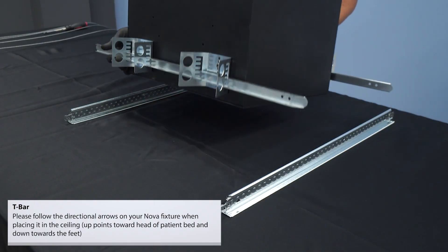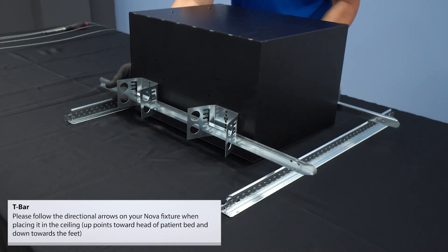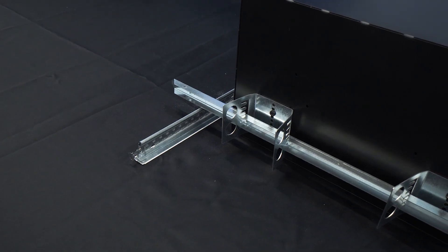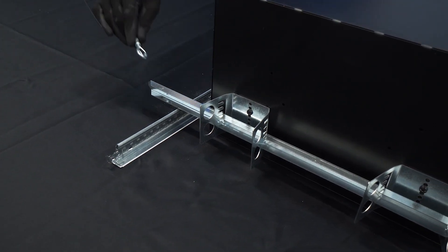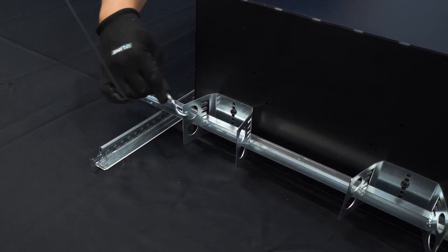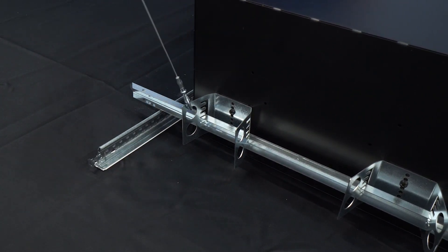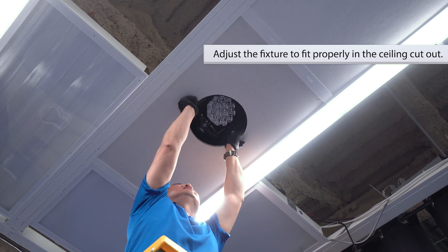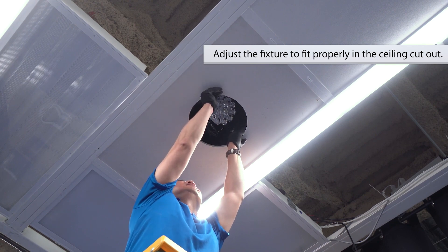For T-bar installations, adjust the vertical position of the mounting bars within the brackets so that parts rest on adjacent ceiling joists. Attach one aircraft support cable to each of the four mounting brackets on the NOVA box and connect them to ceiling supports. Align the bezel with the ceiling opening and attach with the two Phillips head screws.